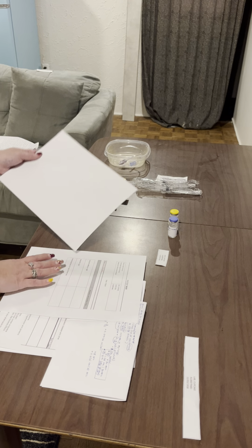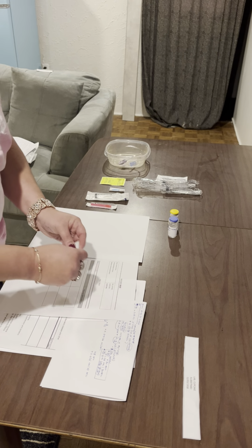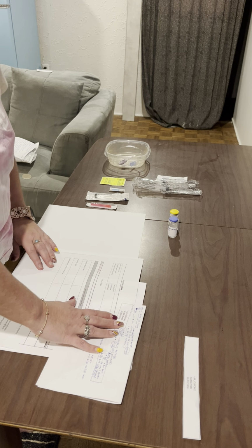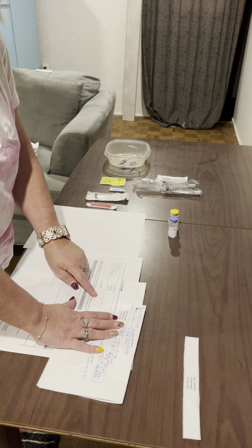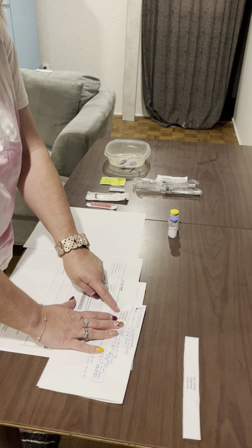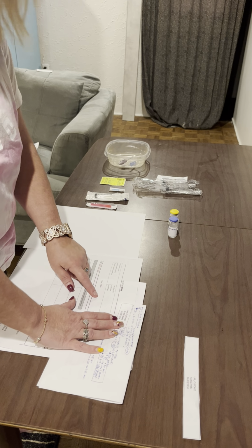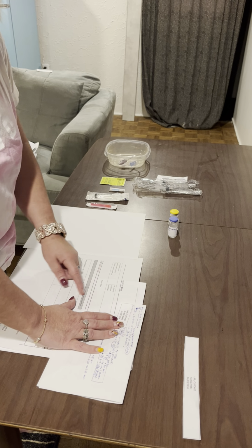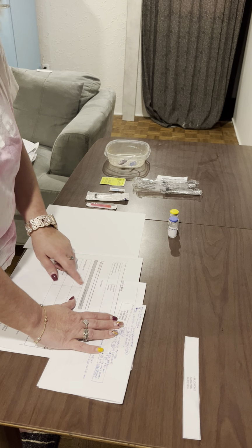Okay. So after we've checked the physician's order, we're going to move on and do the patient MAR. And again, we're going to use the bridger to check the patient MAR. Patient's name is Cupcake Lab. Patient's date of birth is December 3rd, 1958. The number is 79481. The date is today.